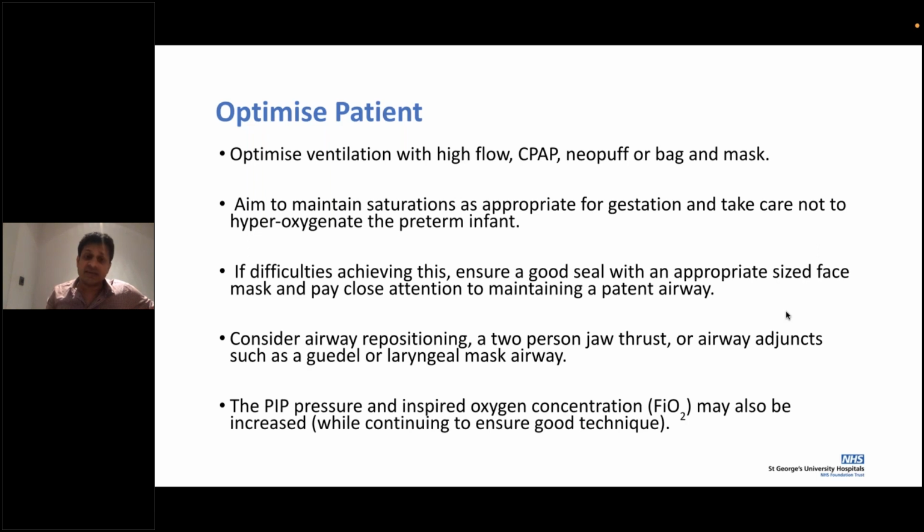Medications are given. If your positioning or chest expansion is not very good, reposition. Consider the two-handed jaw thrust technique, and ensure there is effective chest expansion. Then, when the time is right and your saturations are very good, go ahead with your intubation.